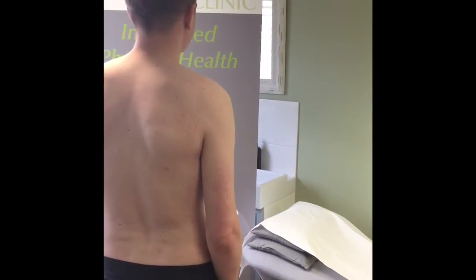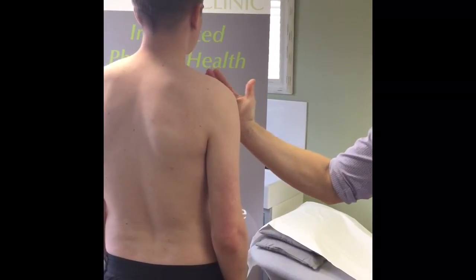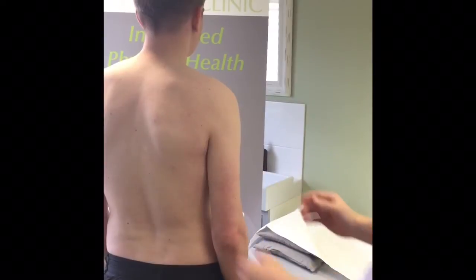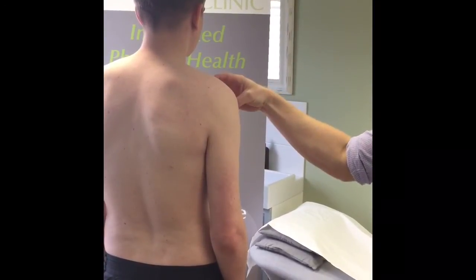This is a demonstration of the application of the NMAS machine for a quite commonly seen shoulder problem, whereby muscles at the front of the shoulder become overactive and tight, and muscles at the back of the shoulder become stretched and weak. Joe does a lot of work at a desk and plays a lot of tennis, and has been complaining of pain at the back and tightness at the front of the shoulder.